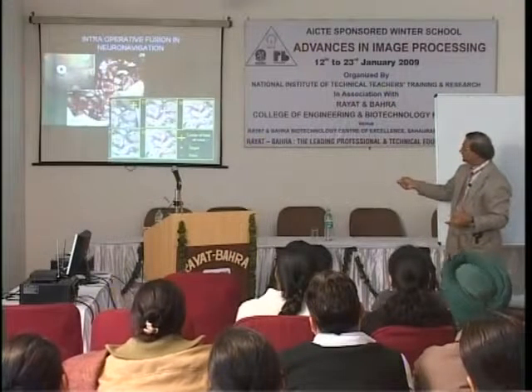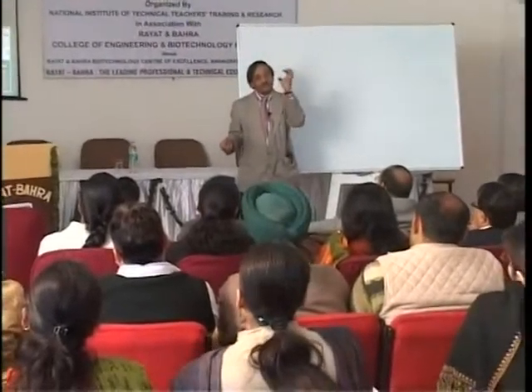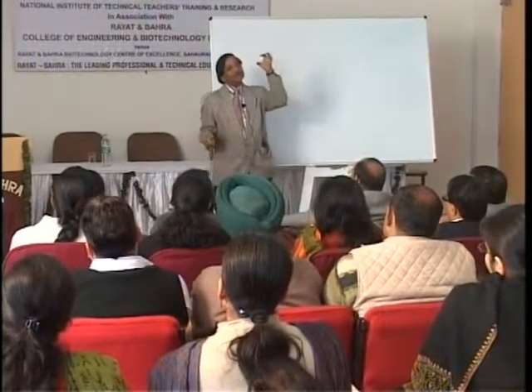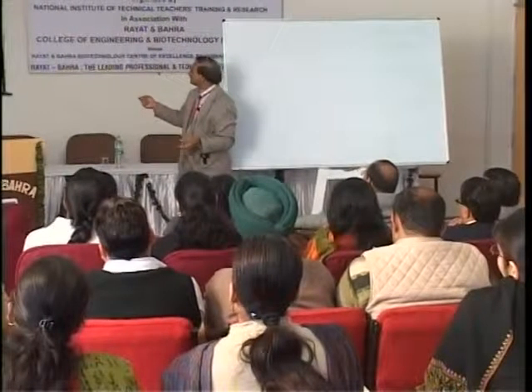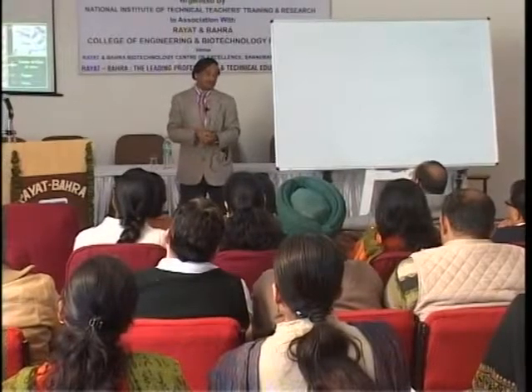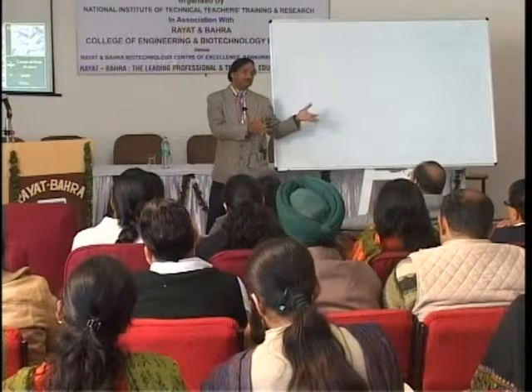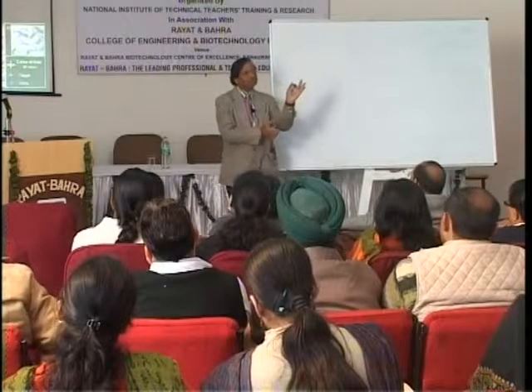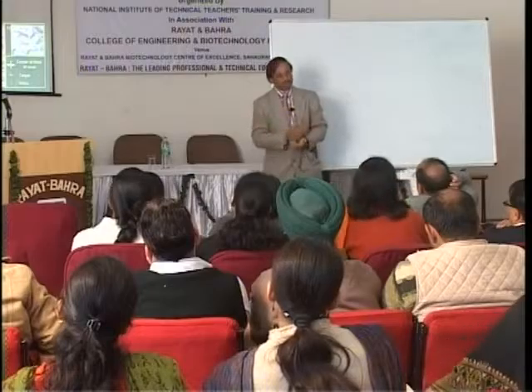So these are the stereotactic frames. Exactly where the lesion or the abnormality is, it will be automatically directed to that particular point. This is what navigation software is. And this is one of the most important software for finding a very, very small lesion, which normally with the naked eye you will not be able to judge.